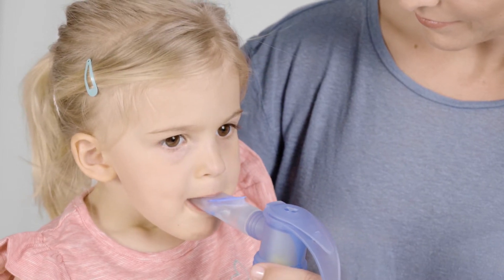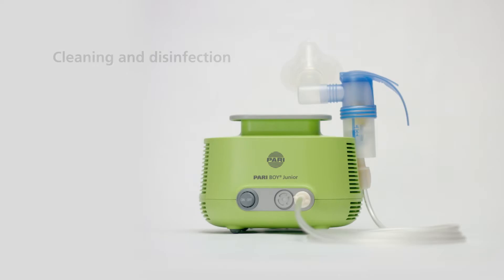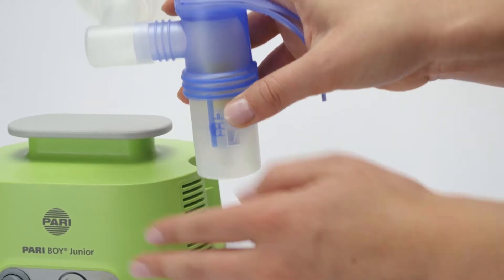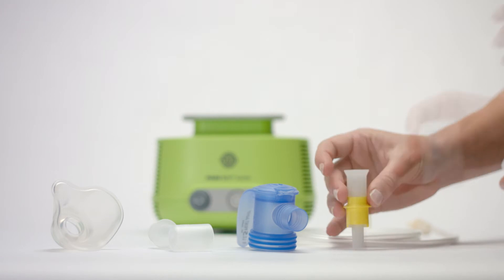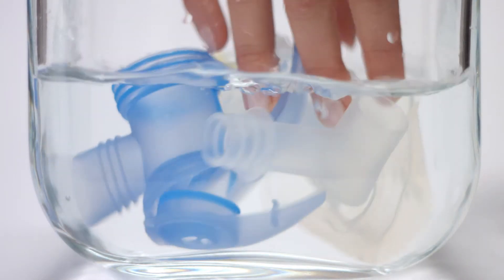Have the child inhale slowly again. When a different noise comes from the nebulizer, this indicates that nebulization has finished. Disassemble the nebulizer for cleaning and disinfection, and clean the nebulizer after each use.